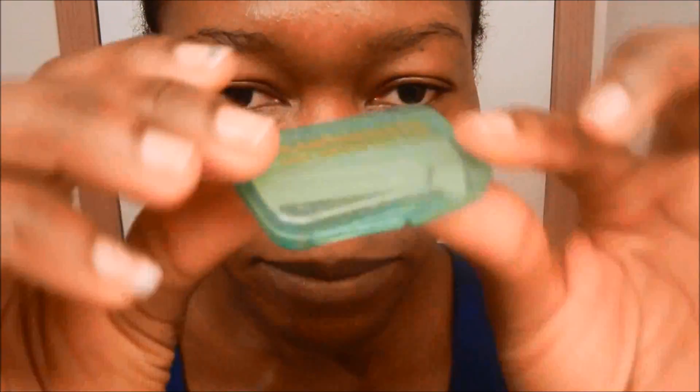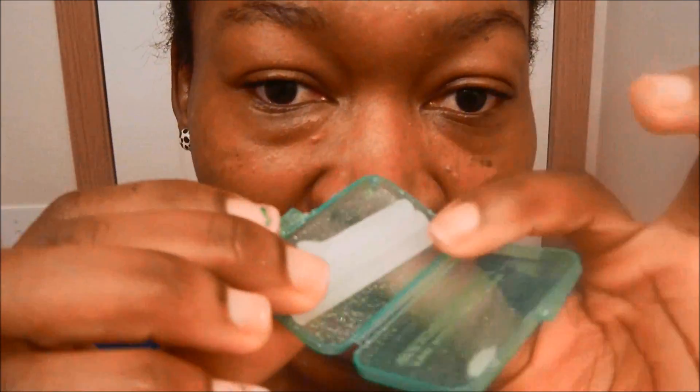So this is the wax. The wax always comes in a case like this — like a little suitcase, like a briefcase. You open it up and the wax is right there. The wax feels like Play-Doh — that's what it feels like to me.